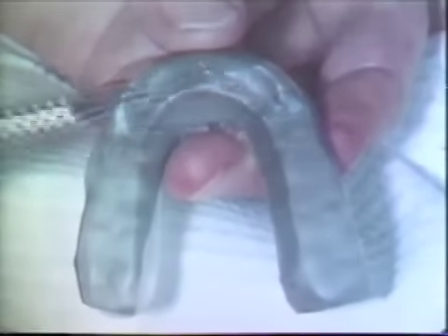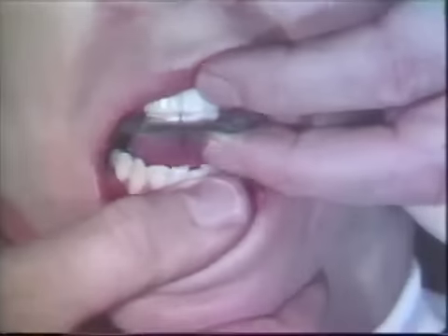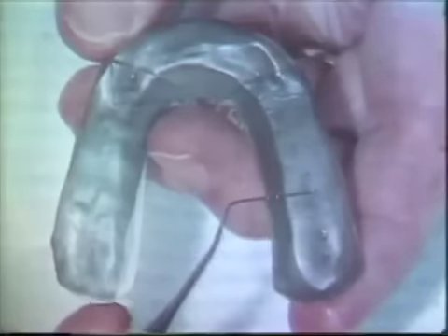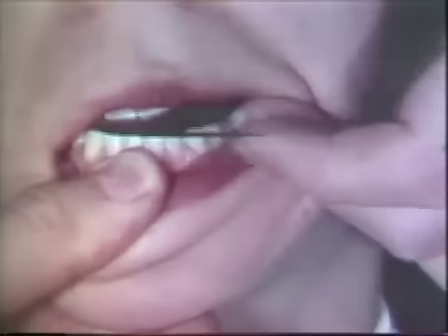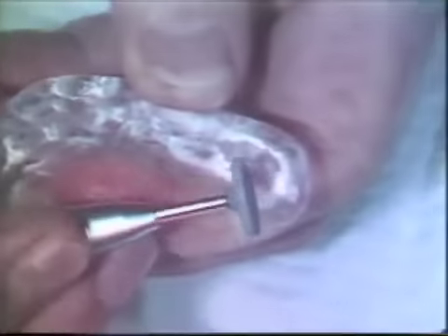Twenty-eight gauge wax is heated slightly and placed over the occlusal surface. The appliance is placed in the patient's mouth and centric relation is recorded. Only a few mandibular teeth penetrated the wax; the heaviest mark corresponds to the left second molar. Very light contacts are seen in the cuspid areas. The wax is removed and the contacts recorded with carbon paper, being used on both sides simultaneously. The heavy contact marks in the left second molar area are relieved.